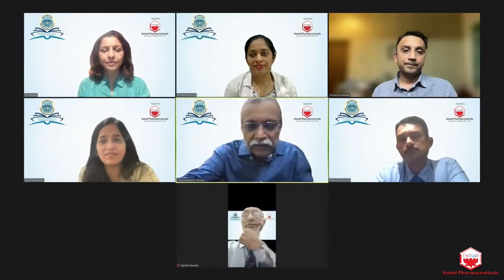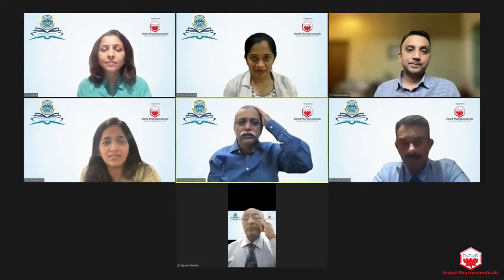But if I have to use Intacs in only one case, that would be post-LASIK ectasia. If I have post-LASIK ectasia with cataract, I would certainly do Intacs first and then plan my cataract surgery. In other cases, my preference would be topo-guided PRK. Dr. Bhavika, your opinion? Yeah, I'll give my opinion, but I would like to ask a question to Dr.